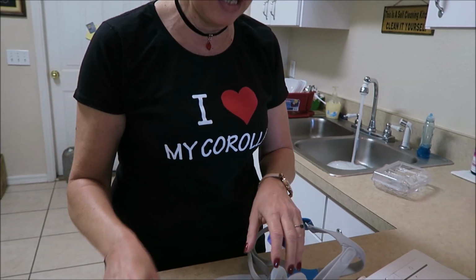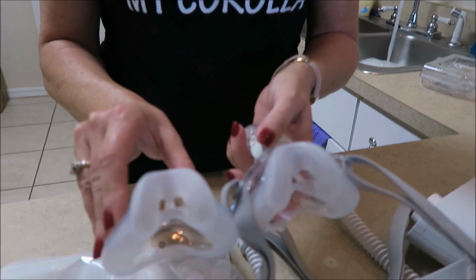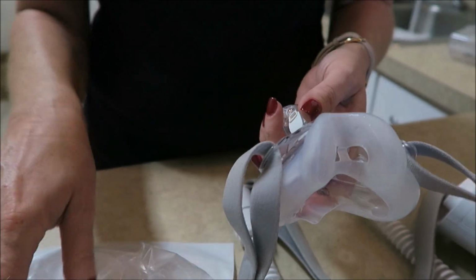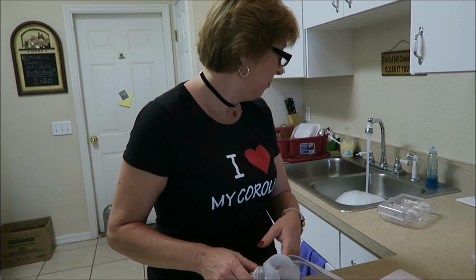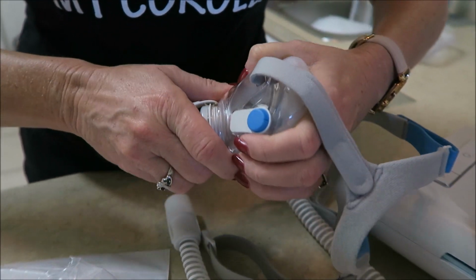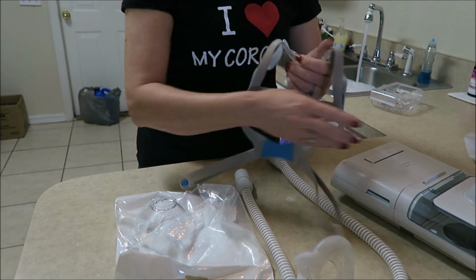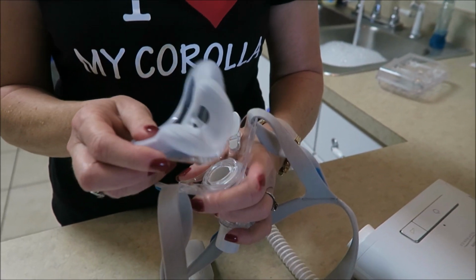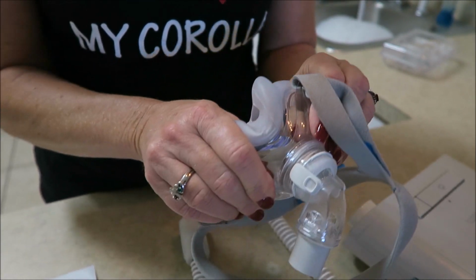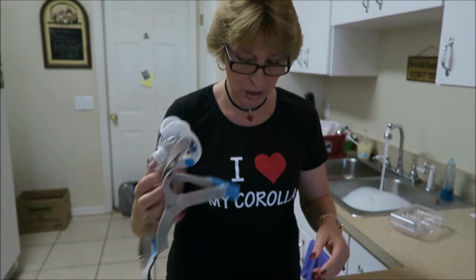My other one I had to change every 2 weeks. Again, it really doesn't look that bad, but with it being what they call the cushion pillow, even with washing it every day, it does absorb the oils from your skin. So you have to pop this off like that. And then you just pop this one on. See, it's not that complicated.